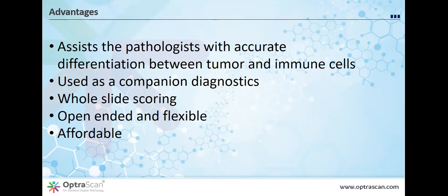The algorithm does well on those. Does it get it right every time? That's probably not, but does the pathologist get it right every time? The answer is no. But putting the two together produces a result that is better than either one alone.